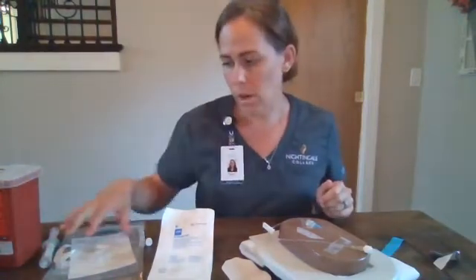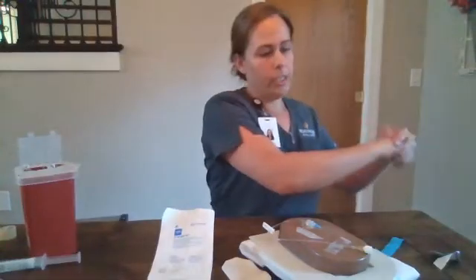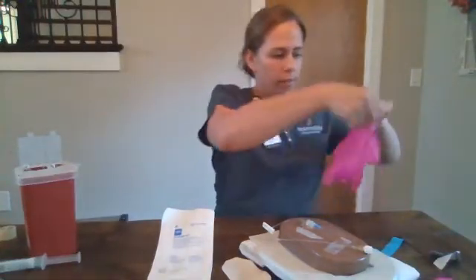When we are ready to discontinue our IV, we will verify that our orders are in. We will do our hand hygiene and place our clean gloves.